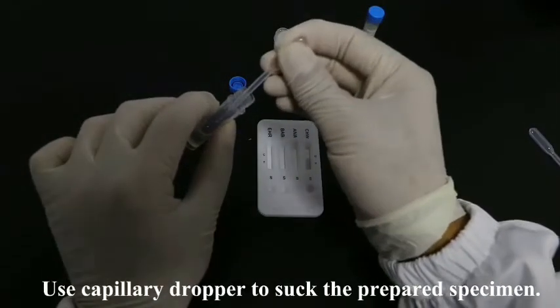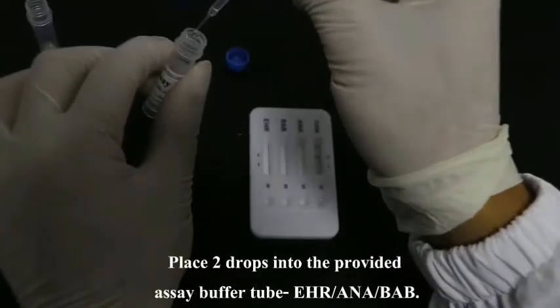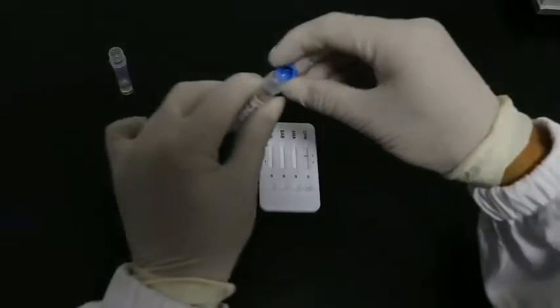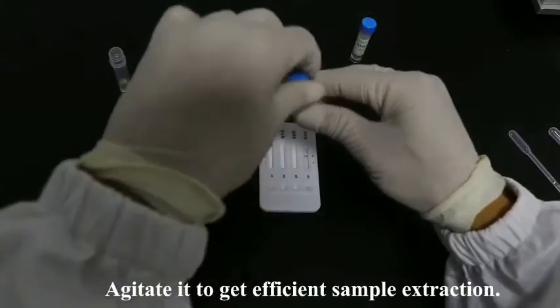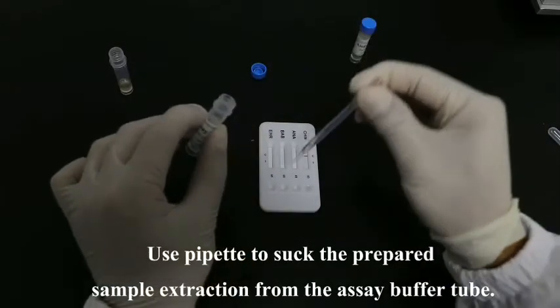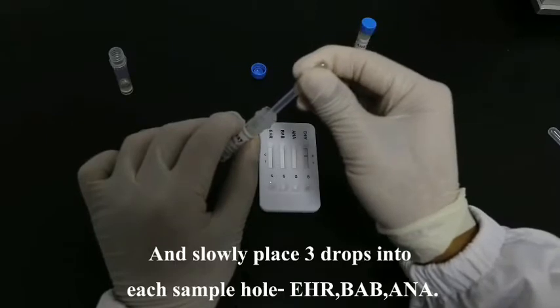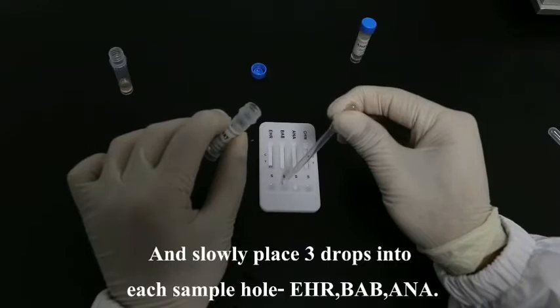Use a capillary dropper to suck the prepared specimen and place two drops into the provided S&C buffer tube EHR-ANA-BAB. Agitate it to get efficient sample extraction. Then use a pipette to suck the prepared sample extraction from the S&C buffer tube and slowly place three drops into each sample hole: EHR, BAB, and ANA.